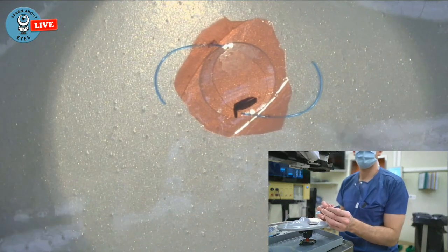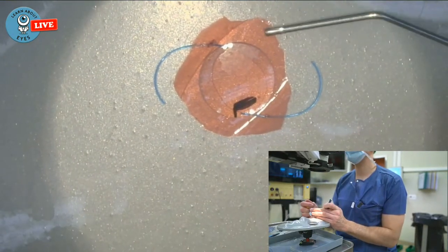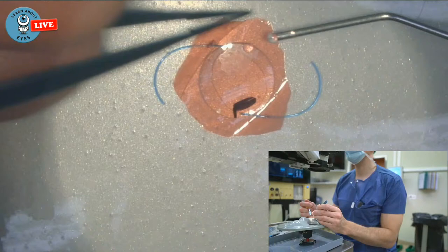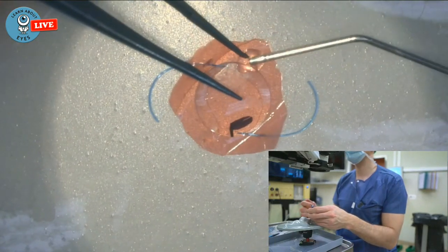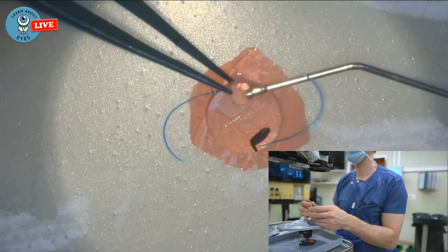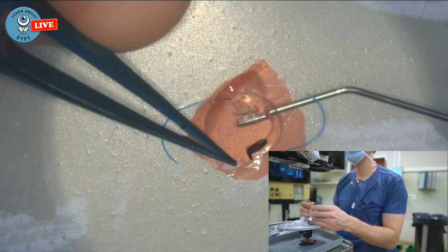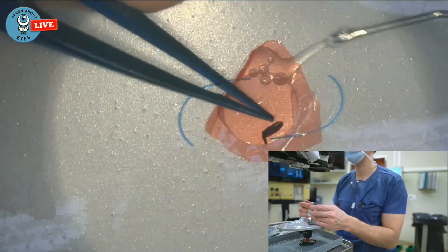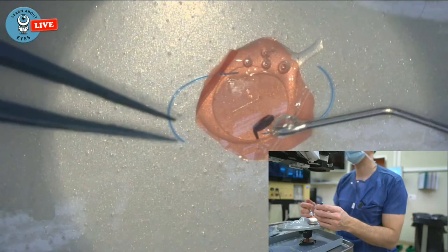Now we're just gonna put a little bit of Visco underneath, I think, so it sticks a bit better to the lens afterwards. Hope this works. Otherwise, not too bad. Okay.